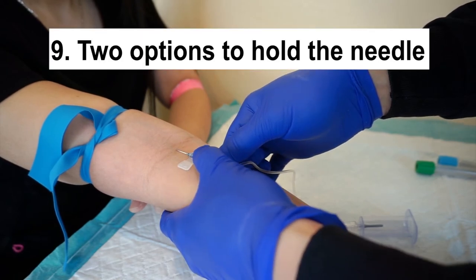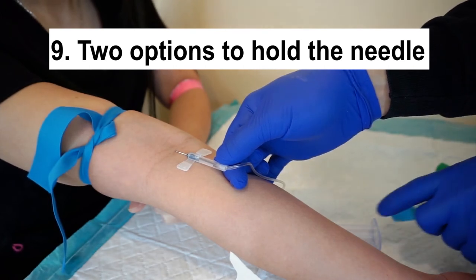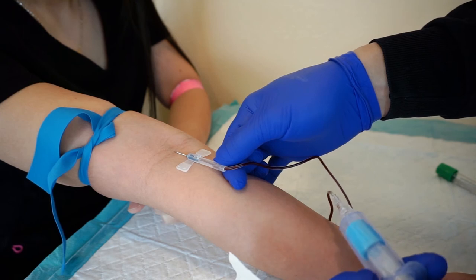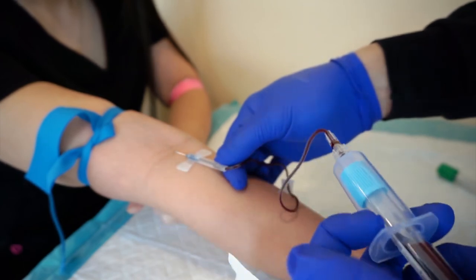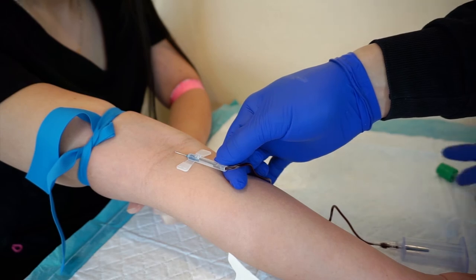Nine. For butterfly, you have two options. First, to let the needle go once you insert it and hold onto the hub as you exchange and fill up each tube. The other option is to keep holding the needle and the hub in a similar manner as a straight needle draw and use the other hand to exchange the tube.